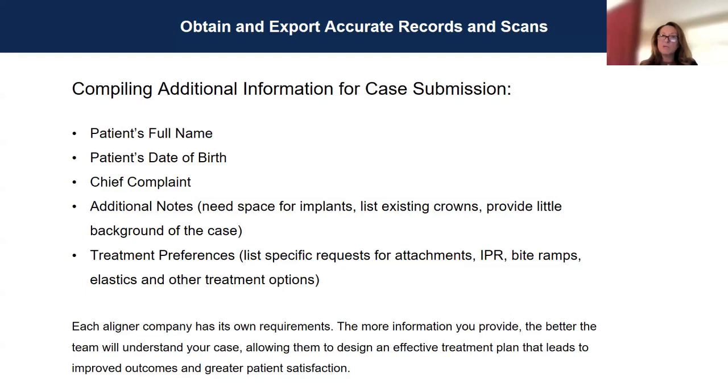So that's interproximal reduction, and see how the treatment plan comes out, and then they can adjust it for what may be needed, depending on the shape of the teeth, right? Some people on their anterior have the black triangle, and that's a good thing to put in the chief complaint if they're concerned about food trapping and their black triangles. They may need a little bit more IPR, that way, when they bring them in, it closes that black triangle.